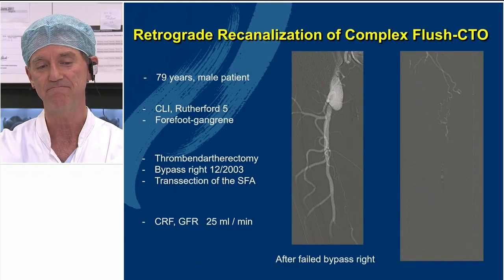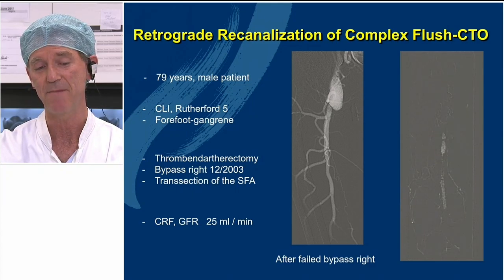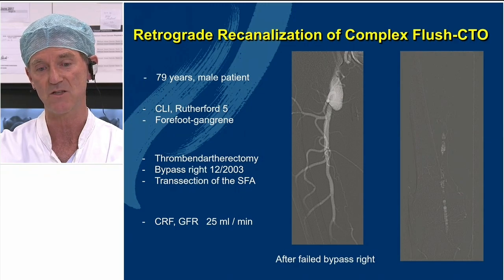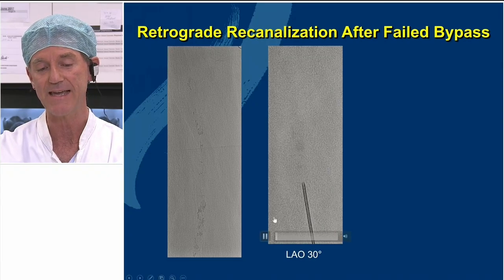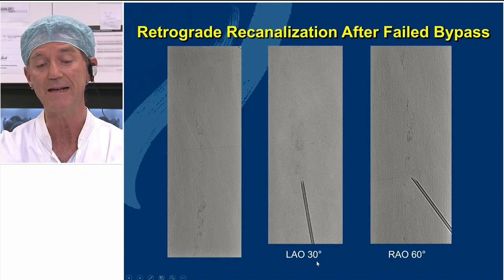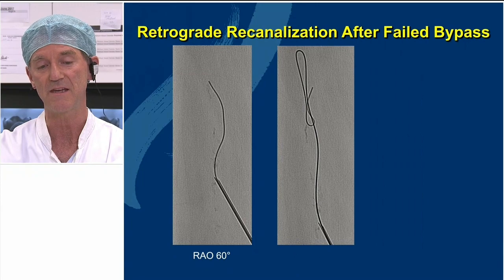Not always that easy. Here is another CLI case where surgery has been done — bypass, also transection of the SFA — and renal failure is also present. So we did this intervention only with CO2. We couldn't get in from antegrade after surgery, so we punctured the total occlusion again. The technique: find some calcium, direct the needle to the calcium, change C-arm positions, and take the stiff Terumo in. If the loop is small, you must be within the occlusion.